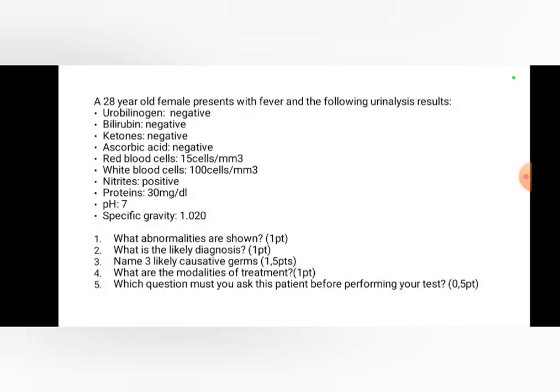Is it clear? Now, we need to know that proteinuria can be divided into 3. The first one is nephrotic range proteinuria, meaning that you have a urine dipstick of at least 3+ and 4+. It means that the urine protein being lost is more than 3 grams in 24 hours. That's a nephrotic range proteinuria.